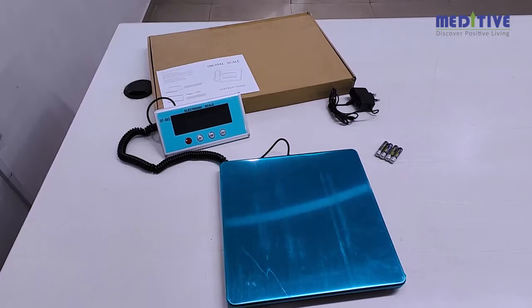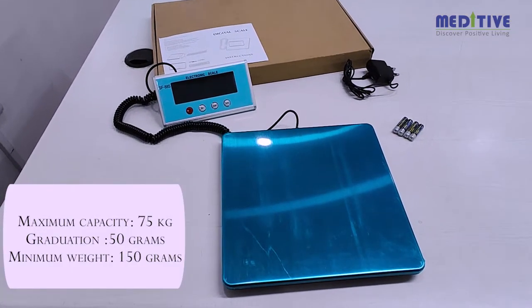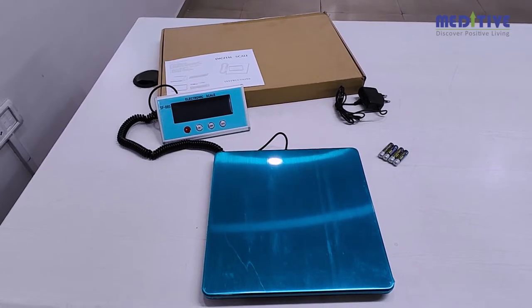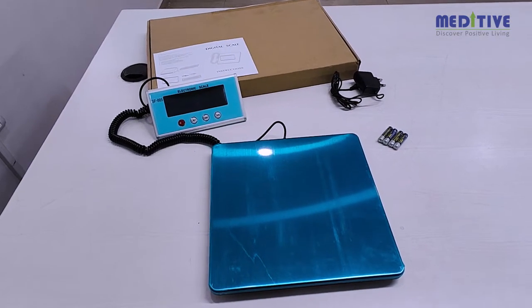Introducing the platform weight scale with a maximum capacity of 75 kilograms, graduation of 50 grams, and minimum weight of 150 grams. The package includes the scale with the attached indicator, four AAA batteries, an adapter, and the user manual.